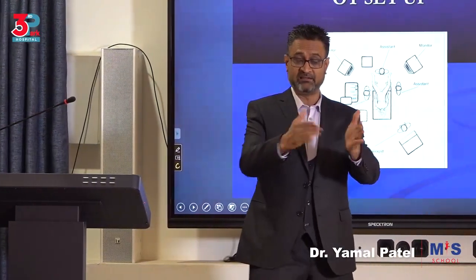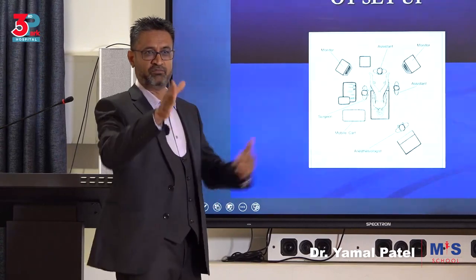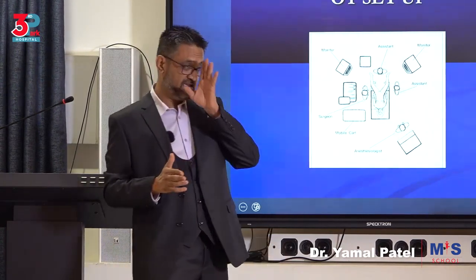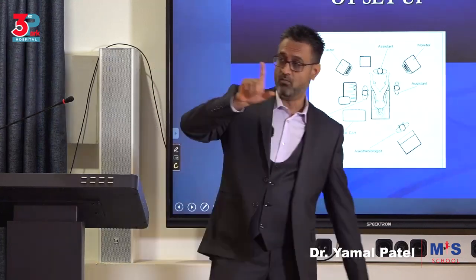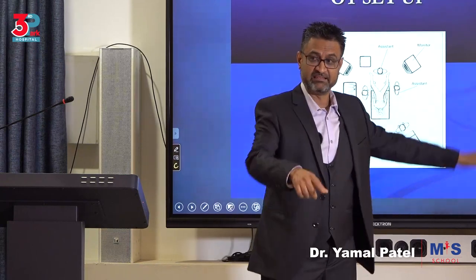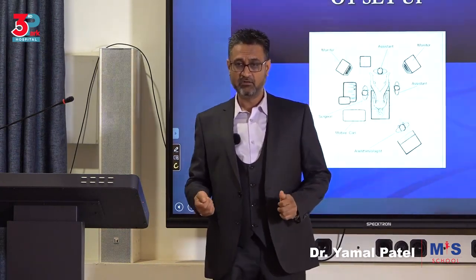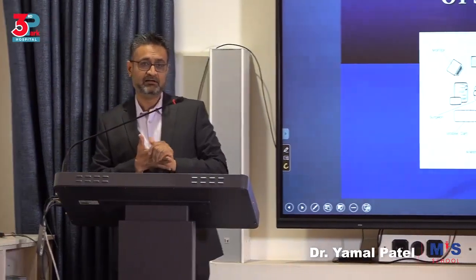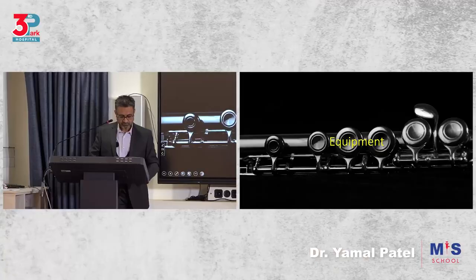Have that one screen put in the middle so both of you are seeing at an angle. But the ideal situation is one there, one here, and if possible, one for the second assistant who is between the legs. Okay? So that is ideal. We do have that kind of a setup in this theater.